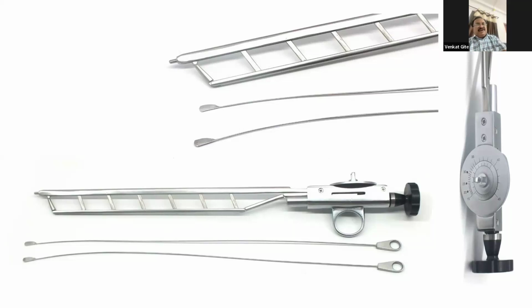Incontinence will not happen. Nothing will happen because that cut is 3 millimeters at one place. And if that particular area is normal, why will it bleed for 3 millimeters?